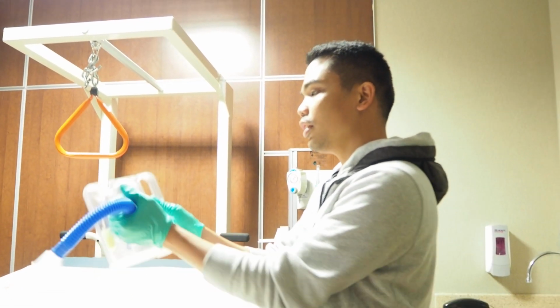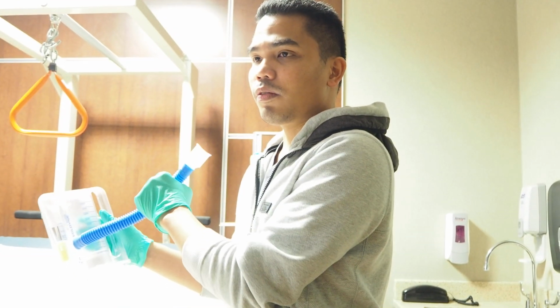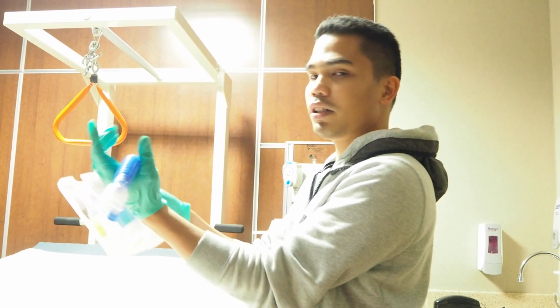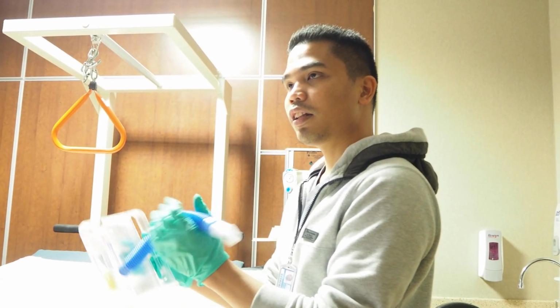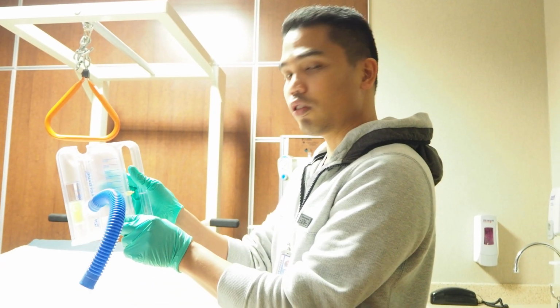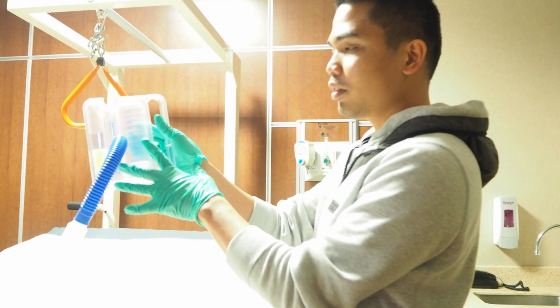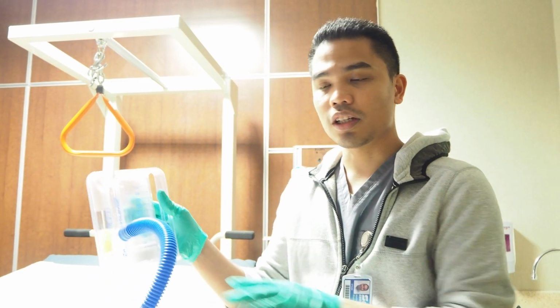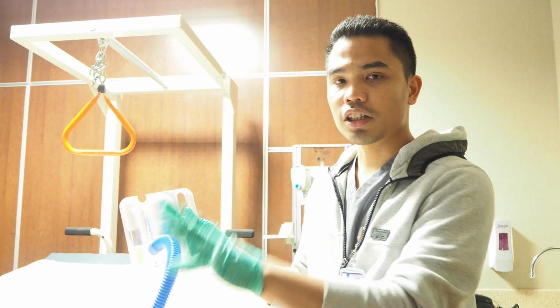And then after that is we let the patient exhale the air out until their lungs are empty, away from the device. After exhaling all their air out, insert the mouthpiece to their mouth with their lips sealed and tongue not obstructing the mouthpiece. And then after that, let the patient take a slow deep inspiration until this white piston would rise. After that you let the patient breath hold for about 3 to 5 seconds, and once the white piston would drop, remove the mouthpiece and exhale normally.